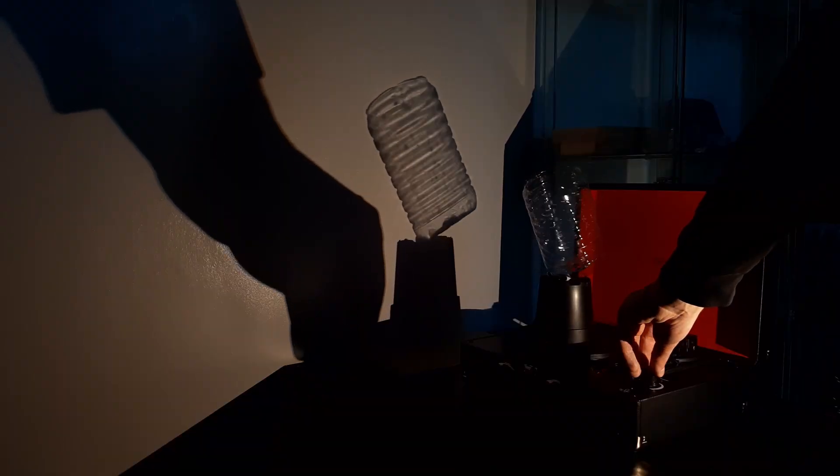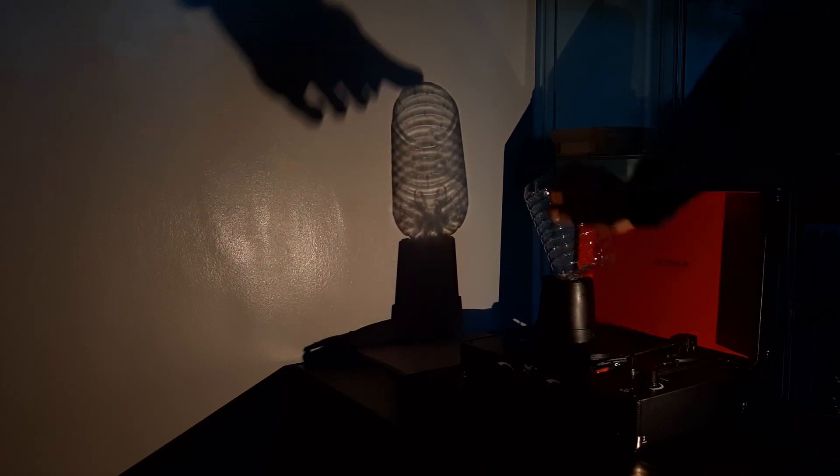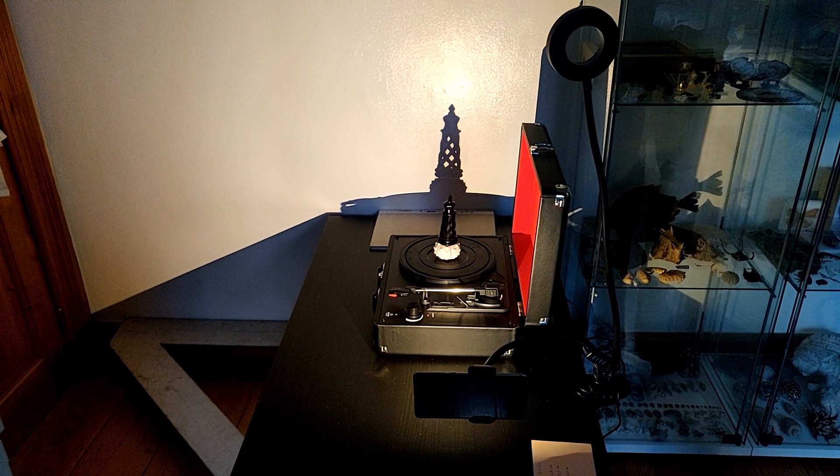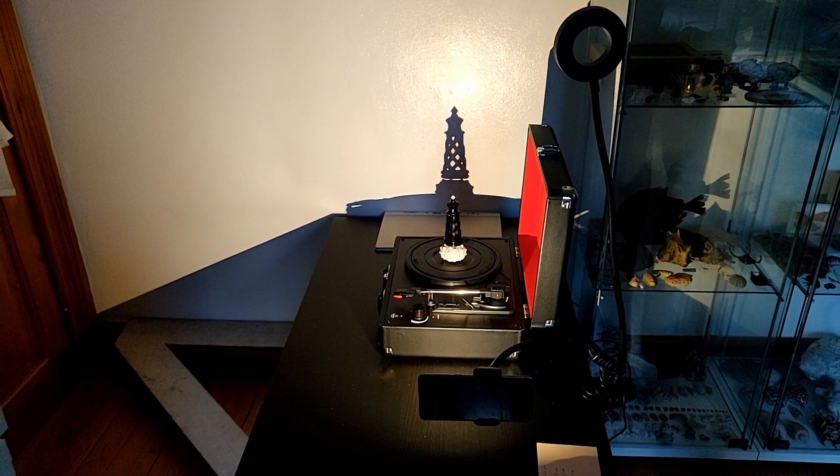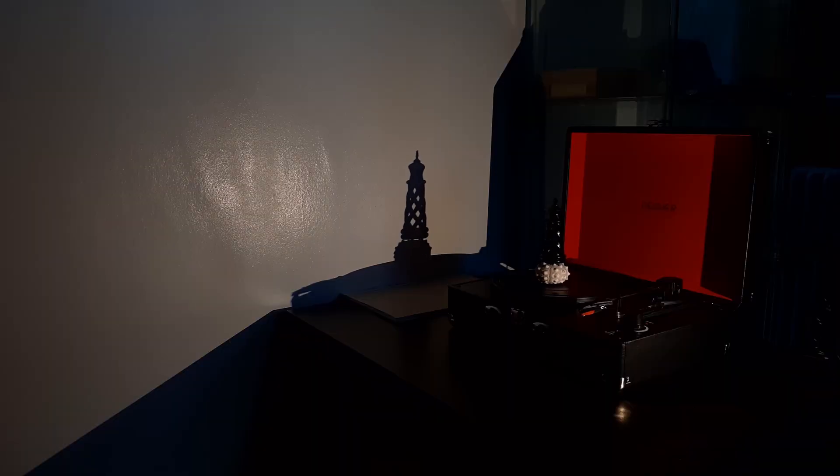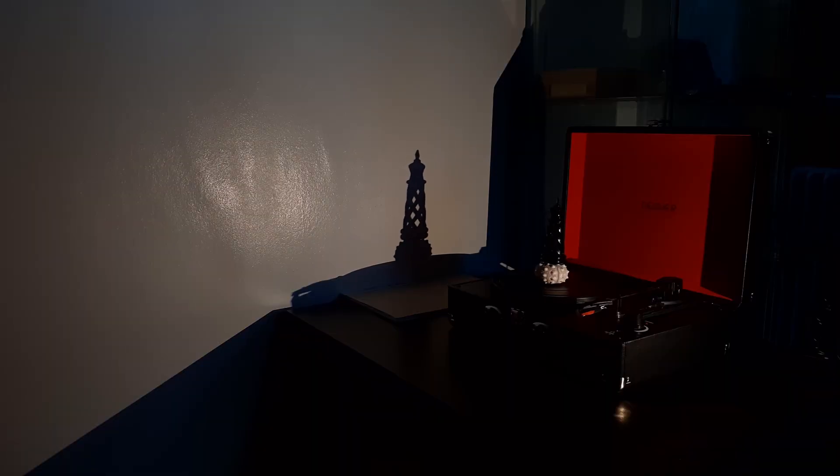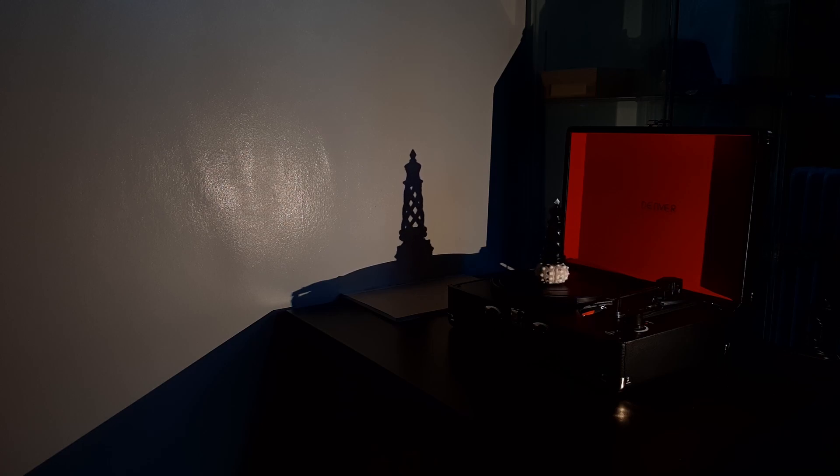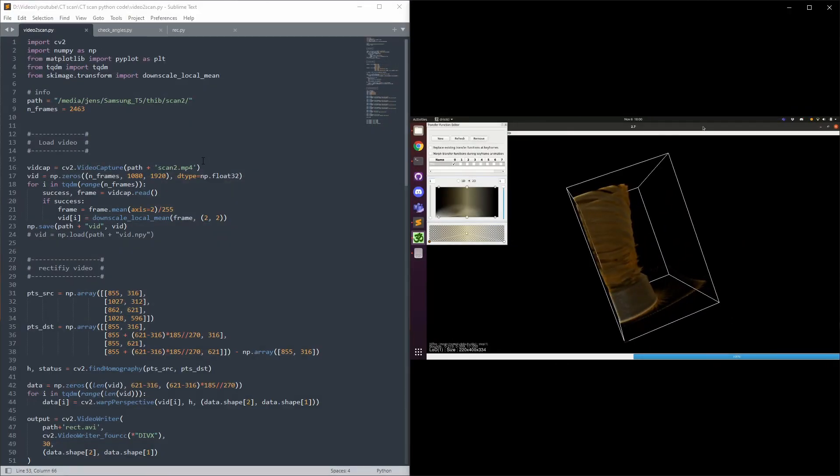Then we measure the flat field, which is the light the detector measures when there is no shadow, and the dark field, which is the background light measured when the light is turned off. We also did a scan of a non-transparent object, a 3D printed black chess piece from one of my previous videos. Go check it out to see what our program would make out of this.